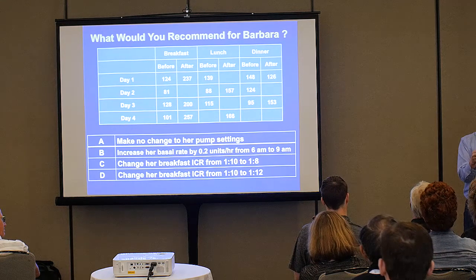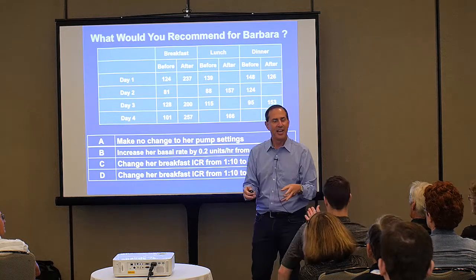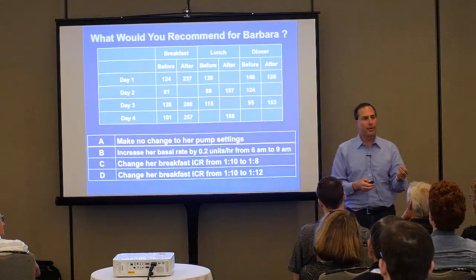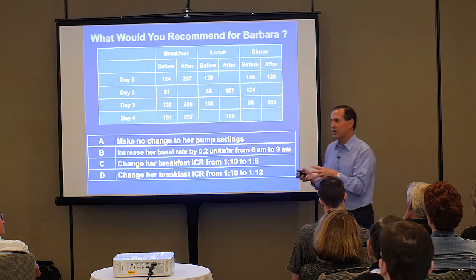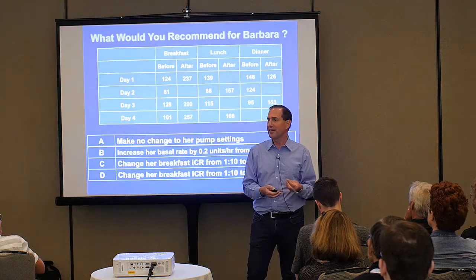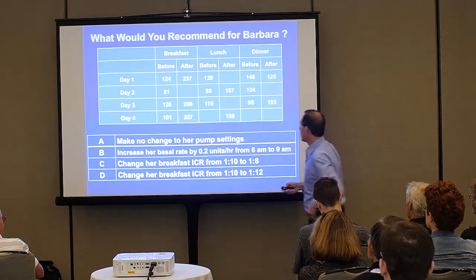So the ideal theoretical world, you know, where life is all happiness and joy, is you bolus around 15 to 20 minutes before eating, unless you're using Afrezza, but for the other types of insulin. Real life is, oh my God, I forgot to bolus, I better do that right now, right? That's real life. But when you can, try to bolus, not talking about Afrezza, talking about using your pump, 15 or 20 minutes before. And most docs who did a lot of this knew that, and a study came out last year that proved that scientifically. It works better, because the insulin has to have time to get into your body. If you bolus right as you start to eat, your sugar's already on the way up before the insulin's doing anything. So when you can, I would recommend that.